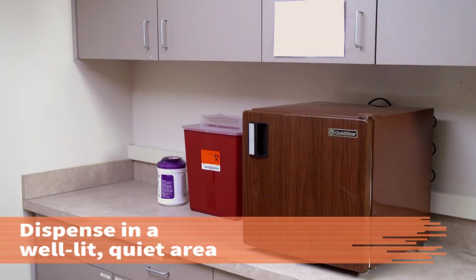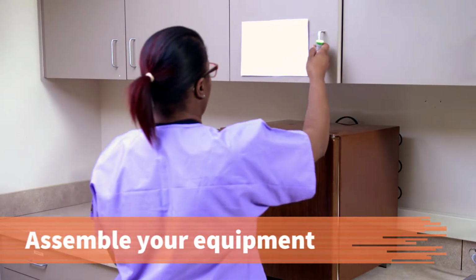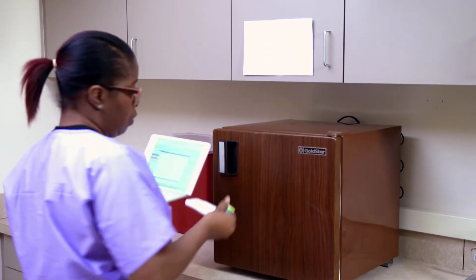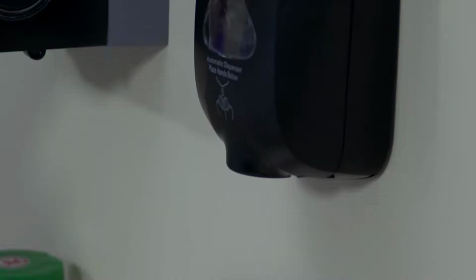Dispense the medication in a well-lit, quiet area. Assemble the required equipment. Choose the correct syringe and needle unit, depending on the site of administration, patient characteristics, and the amount of medication to be injected. Before you dispense the medication, sanitize your hands.